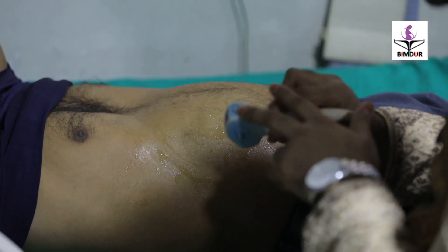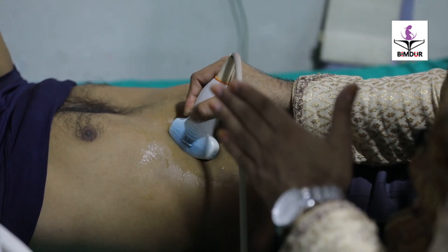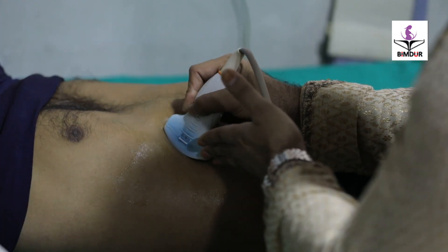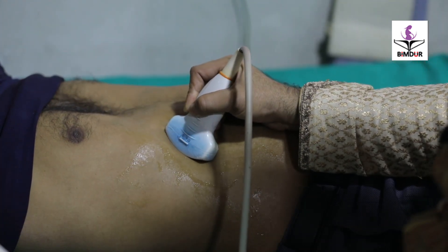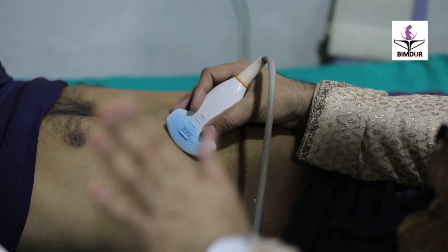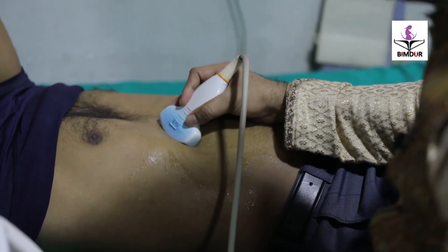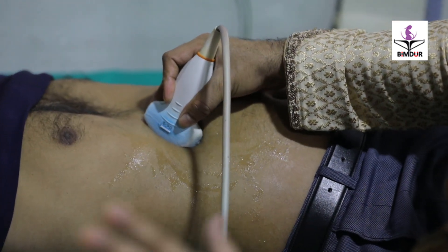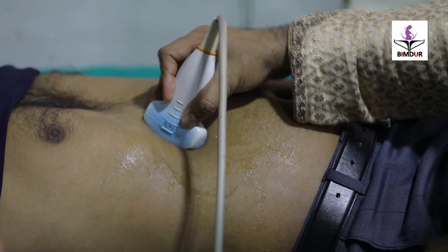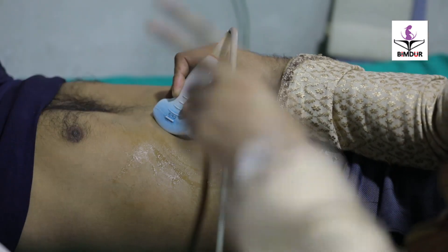This is the protocol of ultrasound. The system is sagittal oblique, placed at the upper abdomen at the mid clavicular line. At that position, your measurement is accurate. This image is very important for proper ultrasonography; otherwise your ultrasonography becomes complex.